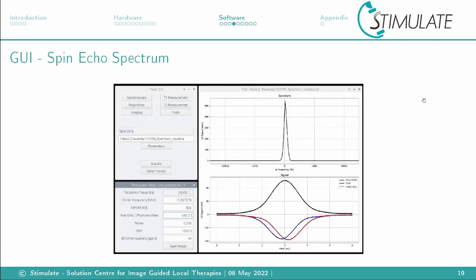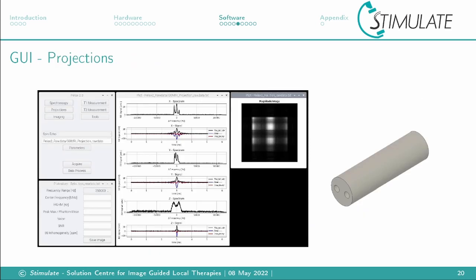Here you see a tabletop spin echo spectrum. On the bottom you see the time domain and the sampling window with the sampling time TS. In the center appears the spin echo blob at TE. On the top you see the frequency domain and the resulting peak from the Fourier transformation of the time signal. On the bottom left you see all the calculated values from the peak, like the maximum, the surrounding noise, and the resulting signal-to-noise ratio.